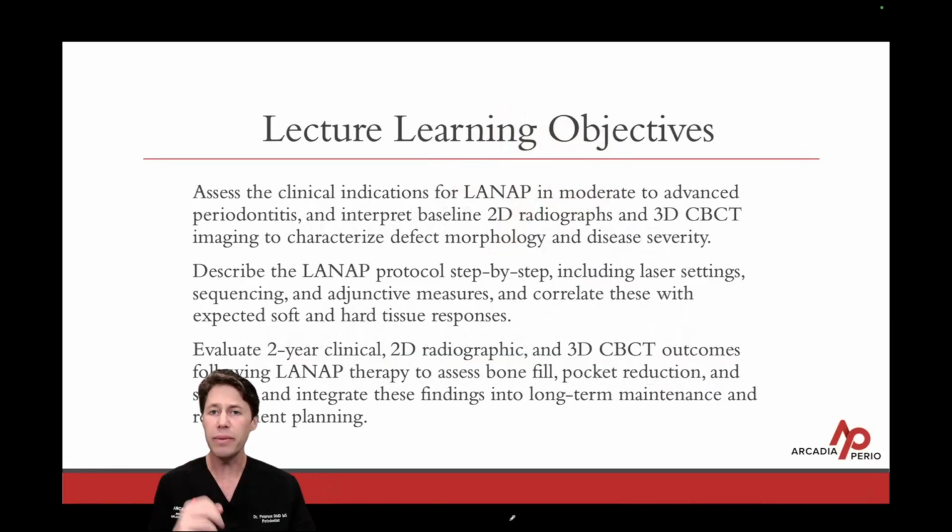So, three main learning objectives that I want you to walk away with from tonight's quick lecture. I want you to be able to assess the clinical indications for LANAP in moderate to advanced periodontitis and be able to interpret 2D radiographs and three-dimensional imaging. Is three-dimensional imaging recommended for advanced periodontal defects around teeth? I would suggest so. I'm going to be able to characterize the defect morphology and the disease severity.